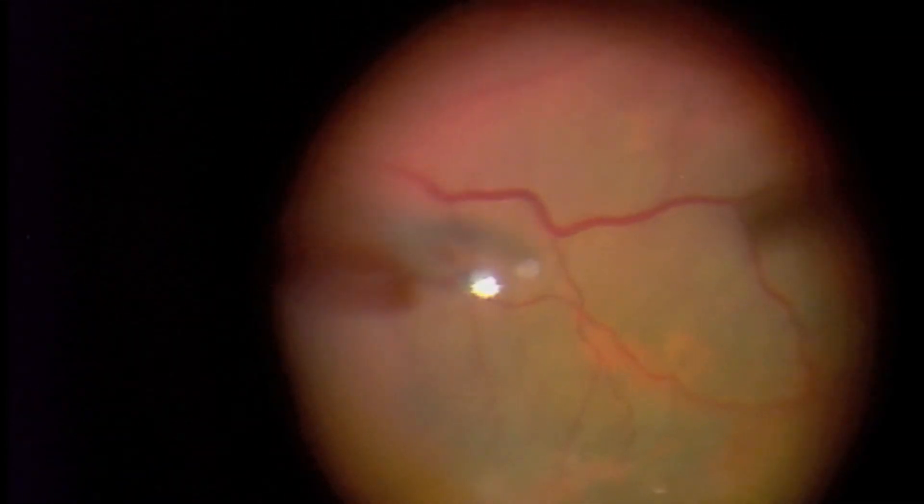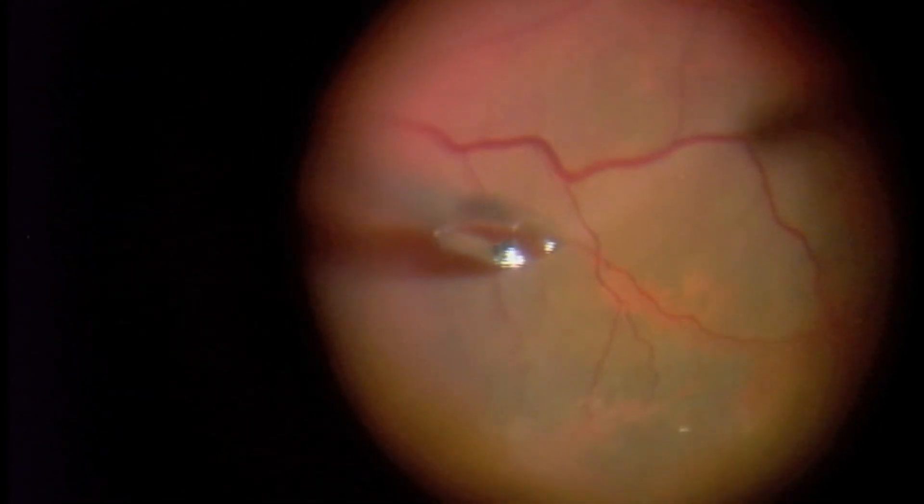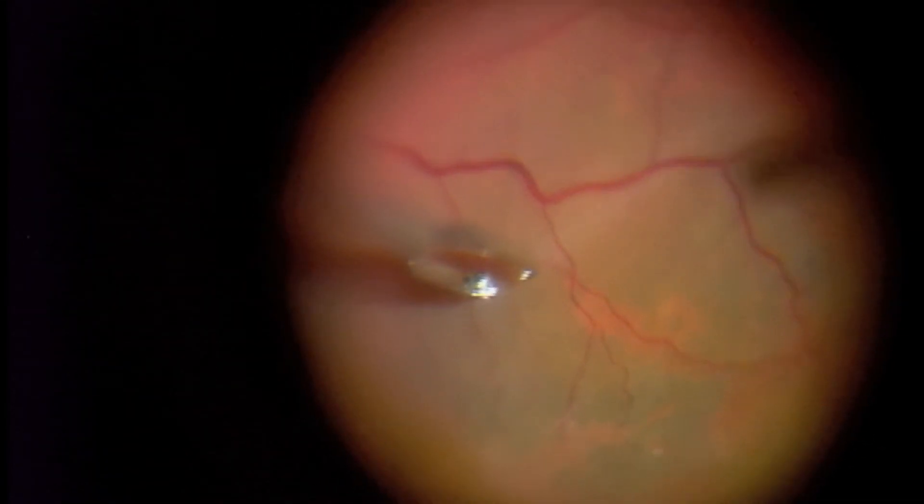The goal of the surgery is to remove the tissue off the surface of the macula because that's the part that gives you 20-20 vision.